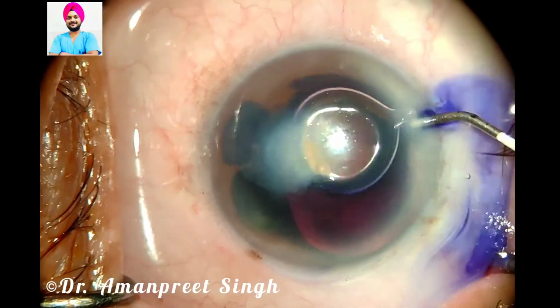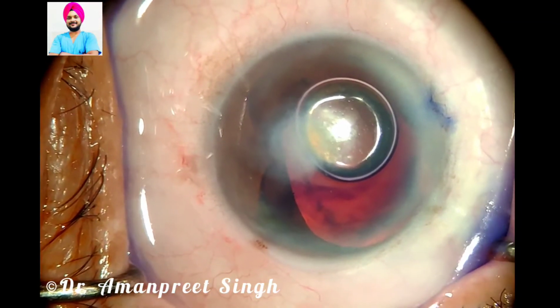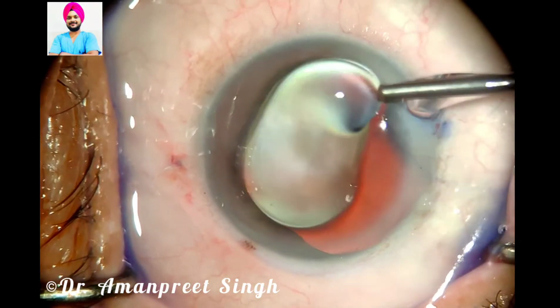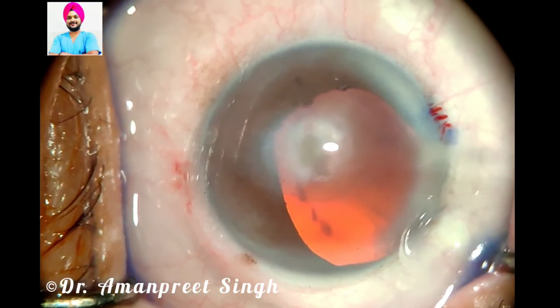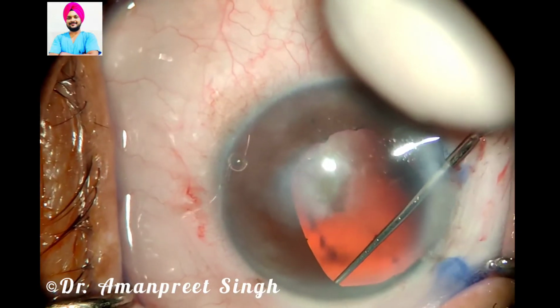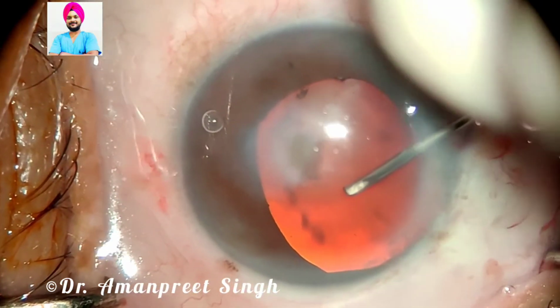Under the air bubble, I have stained the capsule. Now I have washed the dye, maintaining the anterior chamber with the viscoelastic. So my first step will be to break the posterior synechiae in this patient. So I am going with the synechiae hook. You can use a blunt spatula also. And first step is to break the posterior synechiae and free the iris tissue that is in contact with the anterior capsule. So I am using cystitome or capsular access needle in this patient.